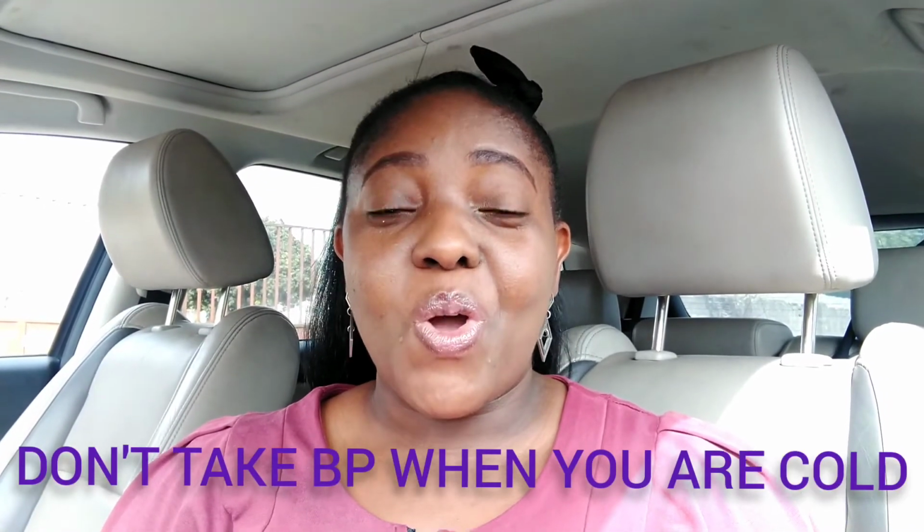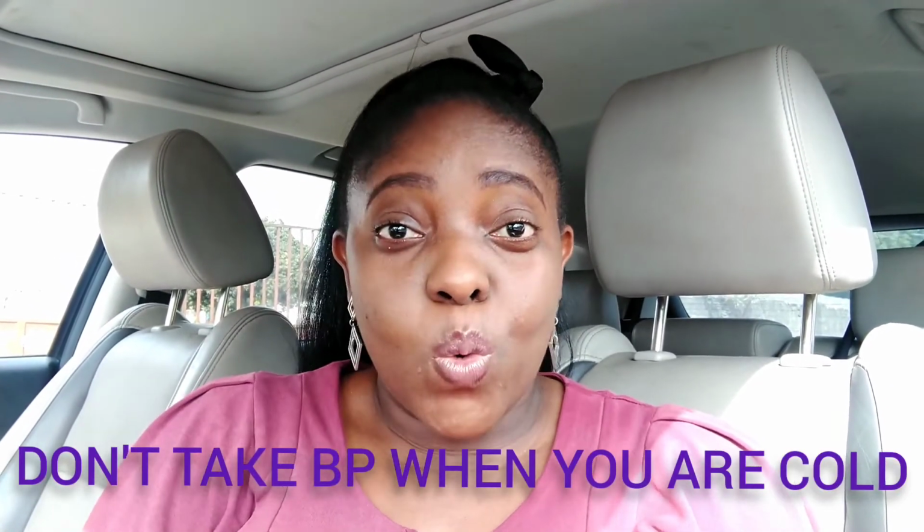Rule number four, don't check your blood pressure when you are feeling cold. When you're cold, it is possible for your blood vessels to be narrow or constricted, and this can cause a slight increase in blood pressure. Rule number five, avoid talking when checking your blood pressure. This can add some numbers to the blood pressure and slightly increase it. So it's important to be quiet and relaxed when taking blood pressure readings.